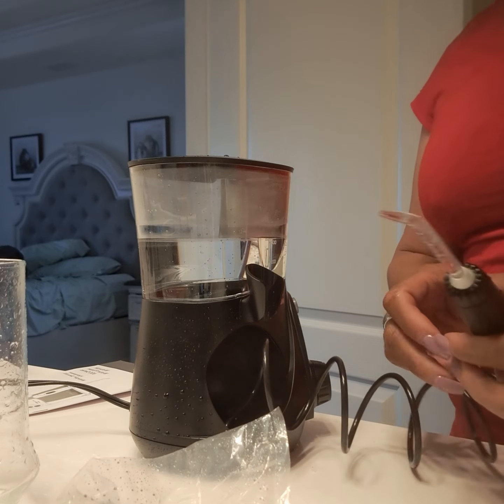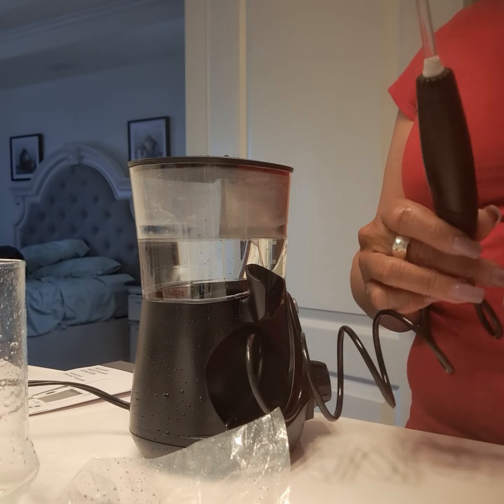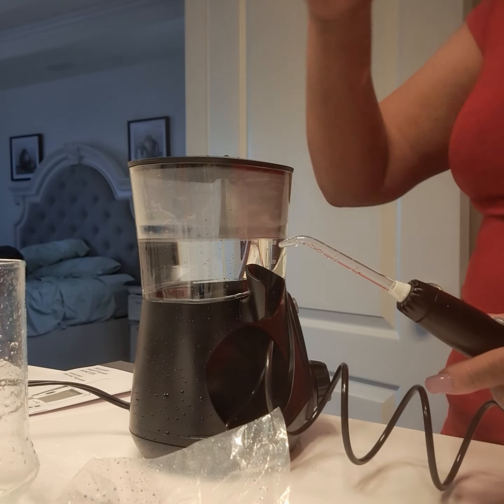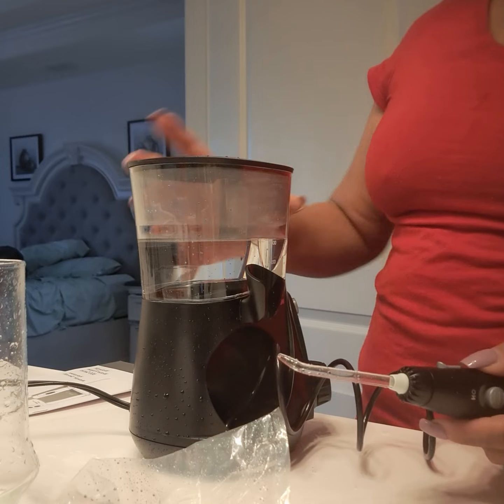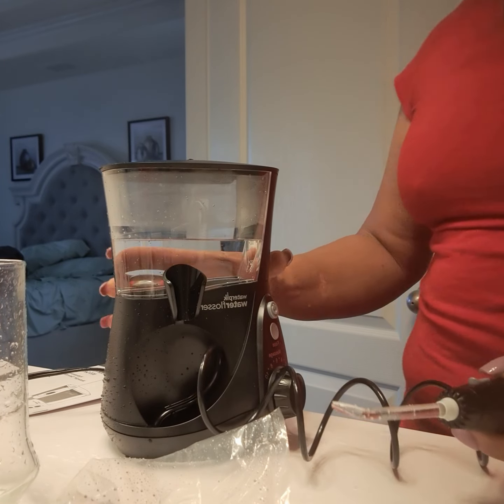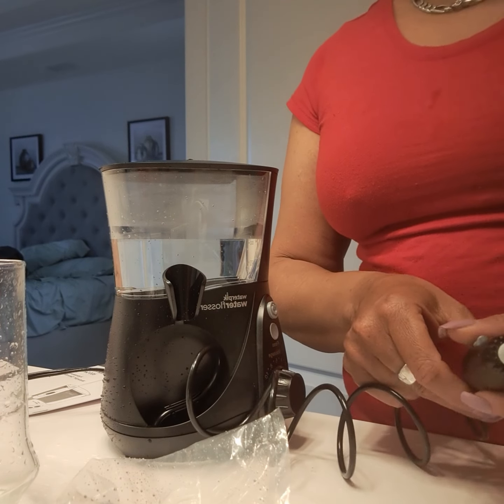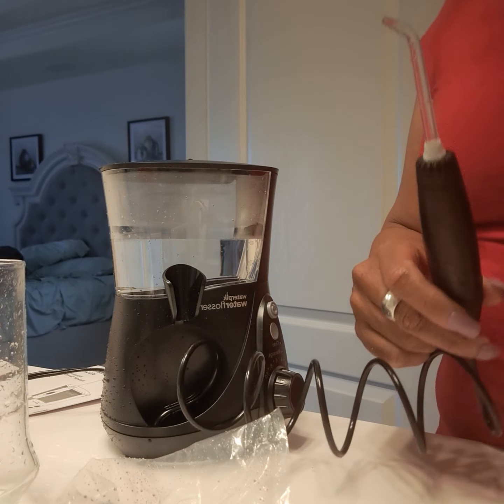I didn't read the instructions because I didn't feel like doing all that, but there's my review. I chose warm water, but you can use it on massage level or floss. I'm going to use it on floss level — I think mine is on eight — so try the water pick if you want.